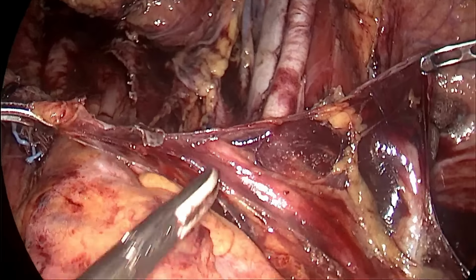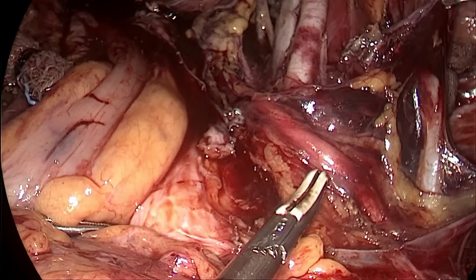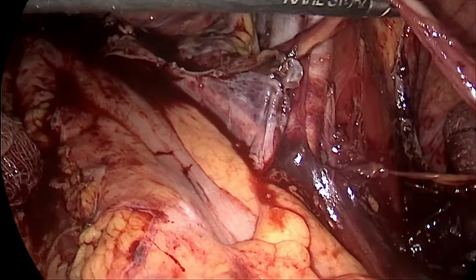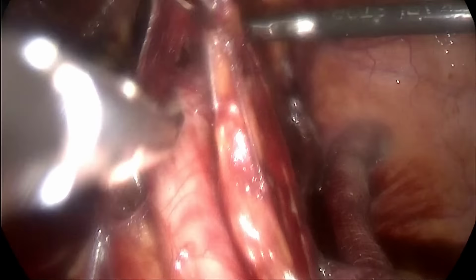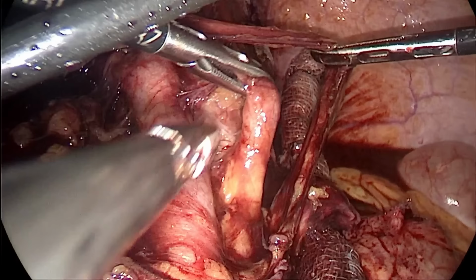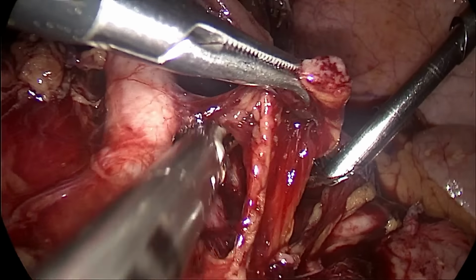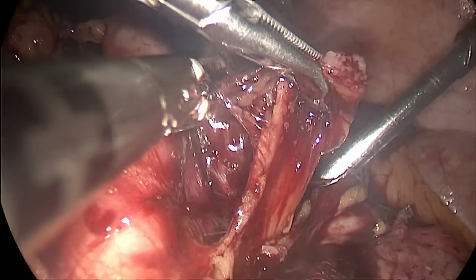So till now we are using 5 ports: one supraumbilical camera port, and on both right and left side 2 assistant ports. So that's our right-sided ureter. I'm trying to separate the ureter from the vessel. Now we are working on top of the common iliac on the right side. That's our psoas major. So that's the right common iliac group of nodes. So below it will be our right common iliac vein, so you have to be very cautious here.